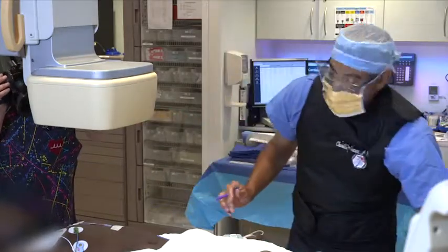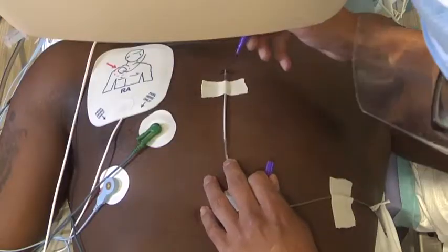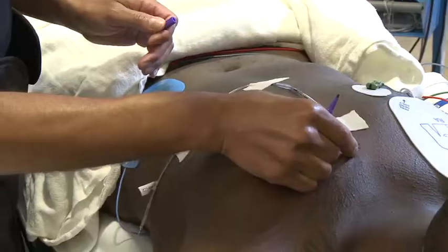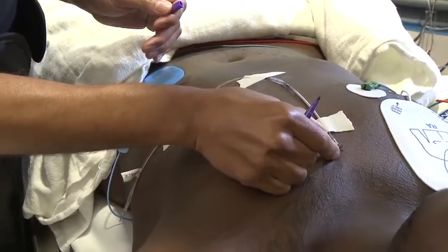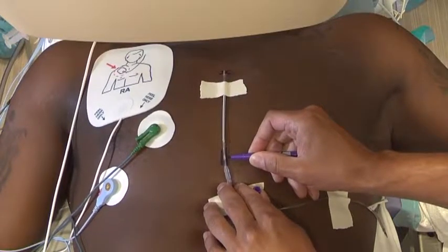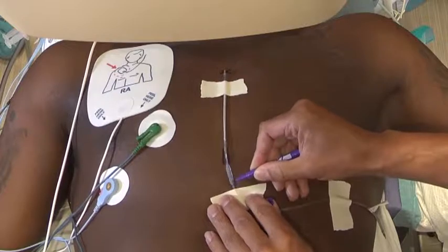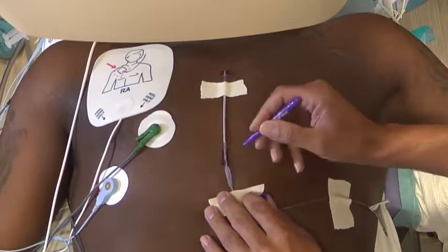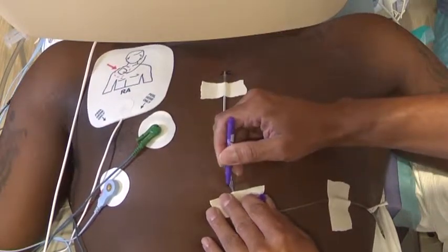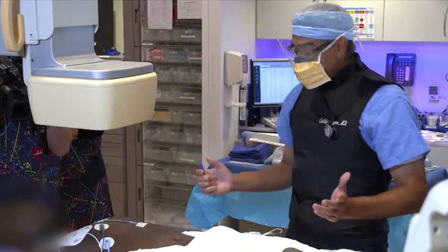I'll mark this off with the pen to get an idea of where we are. I'll put a little X mark — that's the distal limit of that electrode — and make little marks where the electrode is going to run. My incisions are going to be about right there as well. The incision will overlie that distal tip, and there's a proximal electrode — I don't want my incision right over it; I want that electrode in a good solid position for sensing. I'll make the incision a little bit lower, near where the tying sleeve is approximated, about right here as the center of that lower incision.